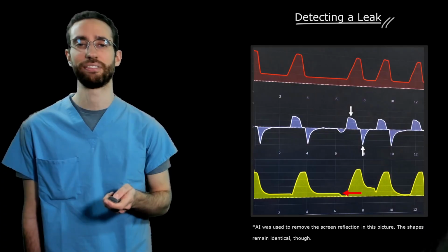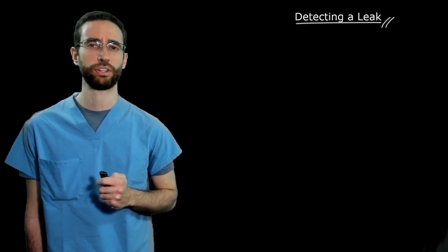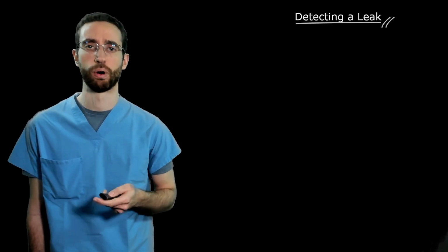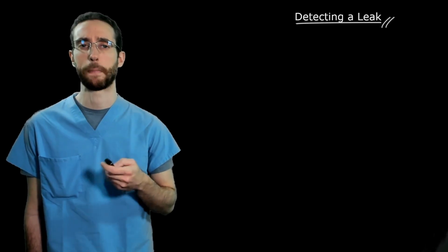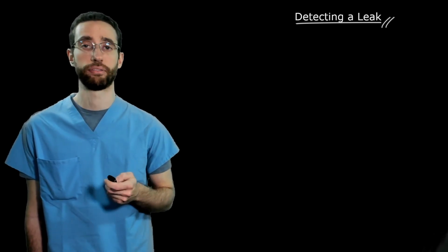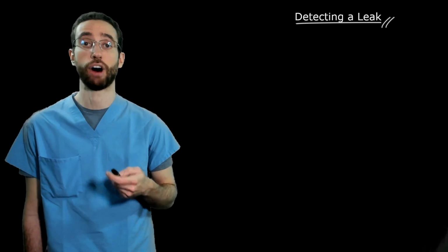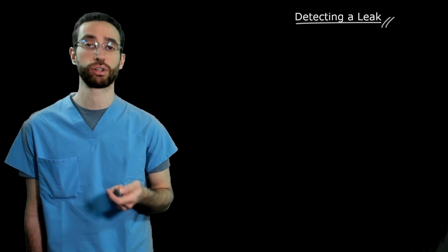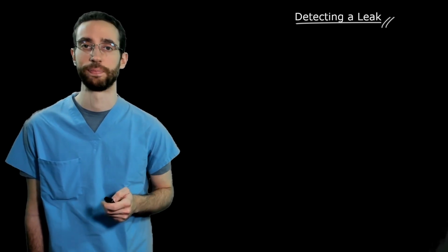One additional sign of a leak may be seen during an inspiratory hold. During an inspiratory hold, we have delivered the tidal volume and the ventilator closes both inspiratory and expiratory valves. The airway pressures measured during a hold should be a function of both lung and chest wall compliance, as well as the volume in the lungs. Since both inspiratory and expiratory valves are closed, airway pressures are constant, forming a plateau.